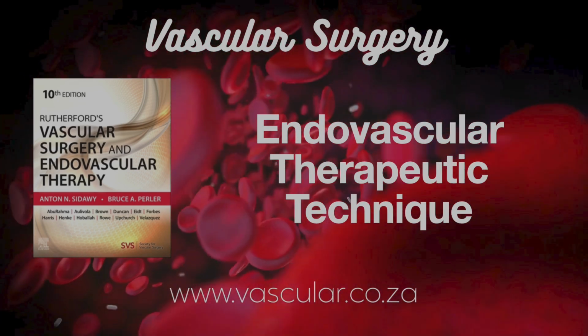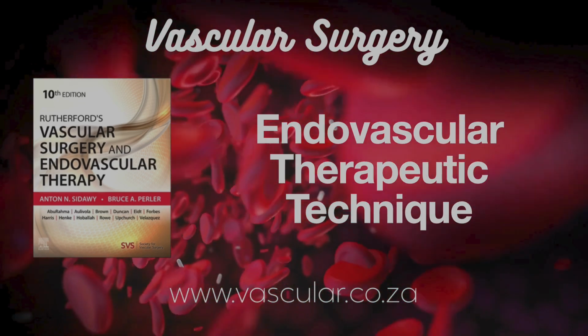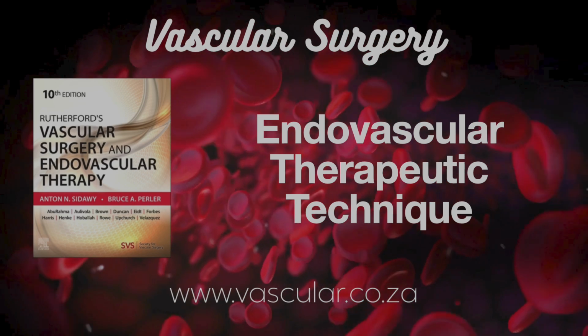Why prep before ballooning or stenting? Good prep minimizes dissection risk, maximizes lumen gain, and sets the stage for implants like stents or DCBs to work optimally. Crucial for calcium.